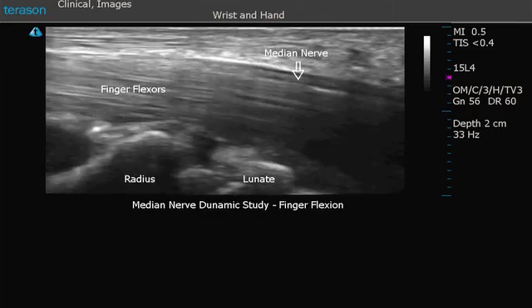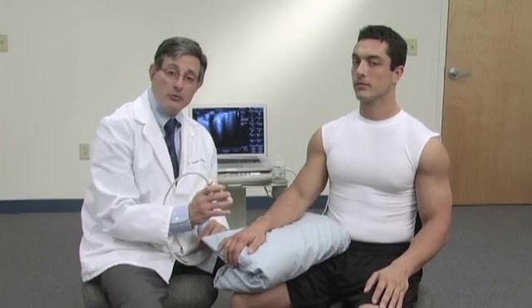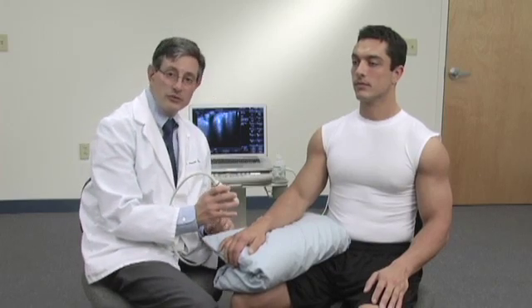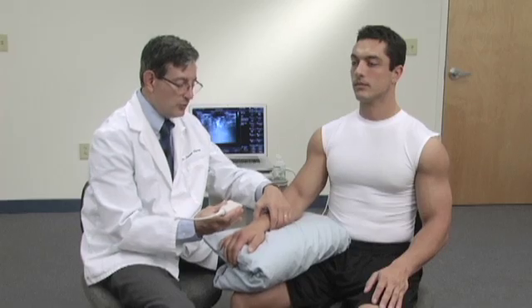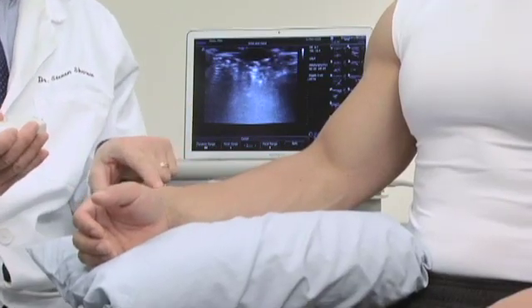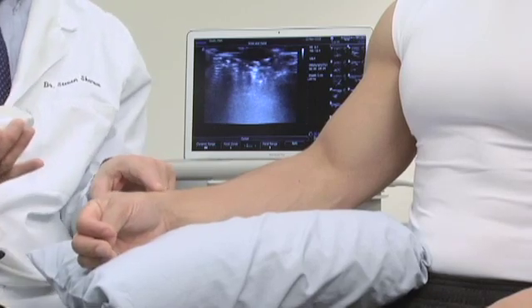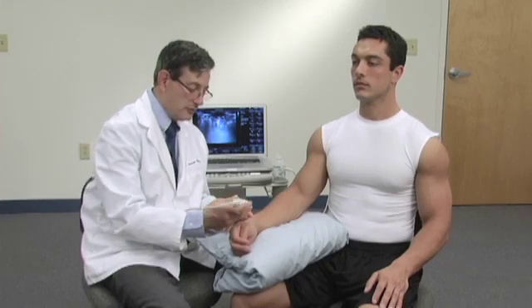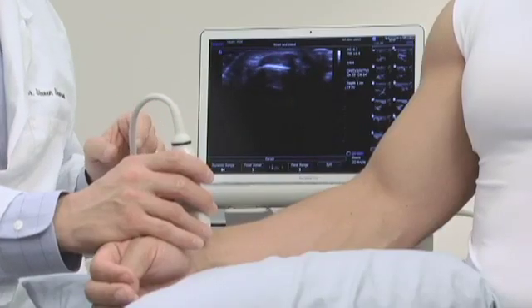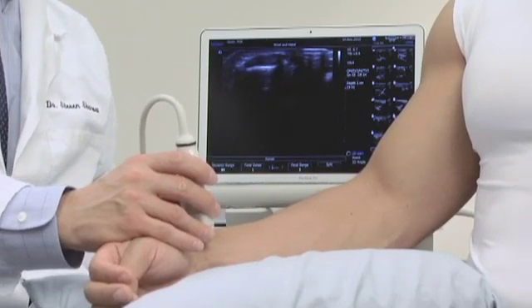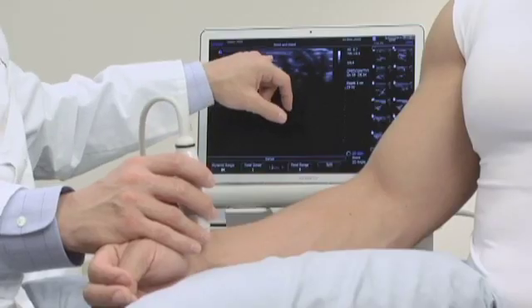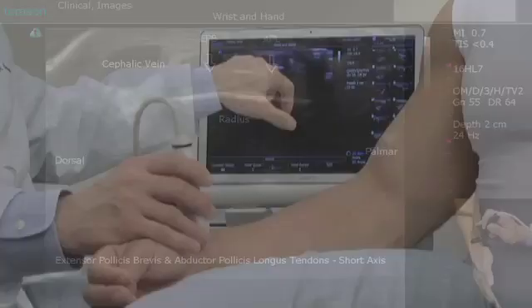They move much greater than the nerve moves. We're going to look at a couple of very important regions in the dorsum of the wrist. The first one we're going to look at is where de Quervain's occurs, in the first tunnel of the wrist. We'll turn his wrist and look in the first compartment at the extensor pollicis brevis and abductor pollicis longus tendons. Over the distal aspect of the radius, we'll see those tendons. Sometimes we'll see a septum between the two tendons. These are the tendons, and there's the bone surface here.